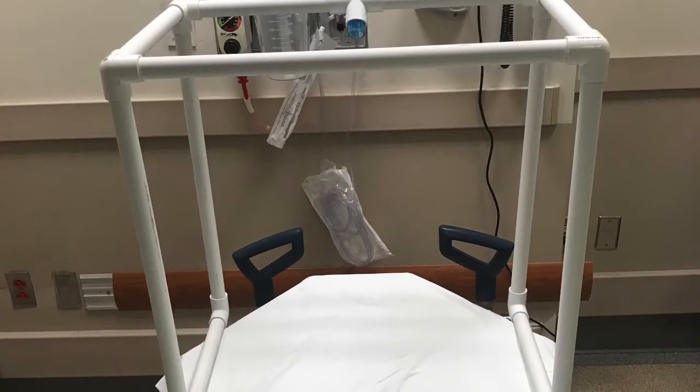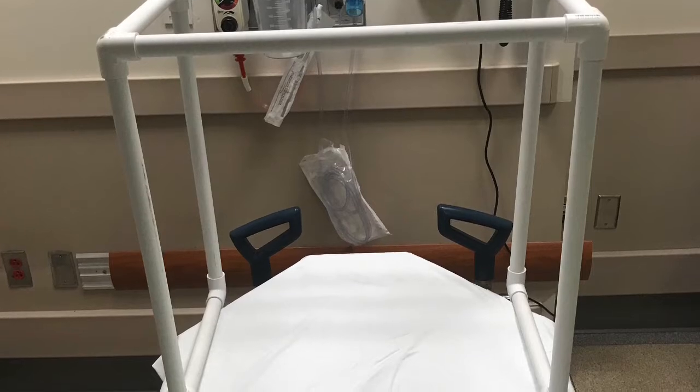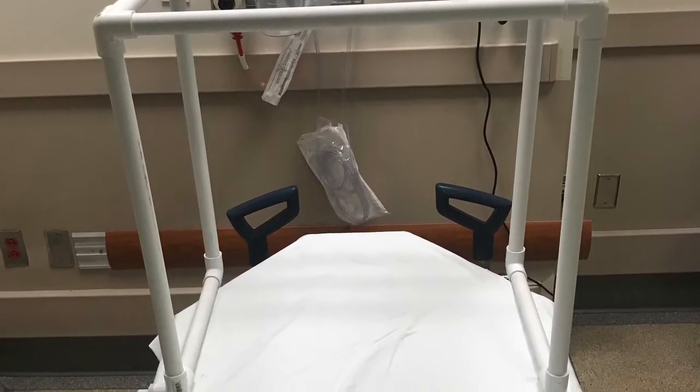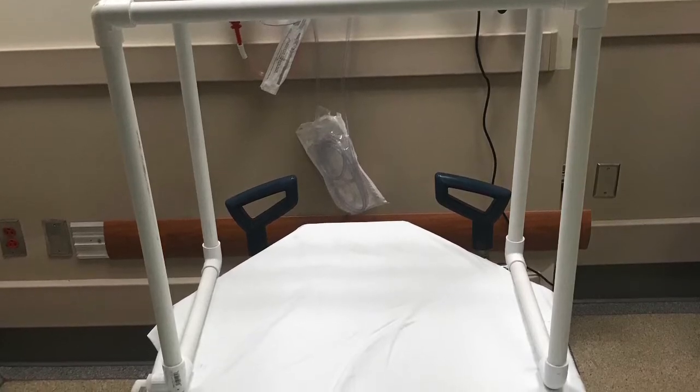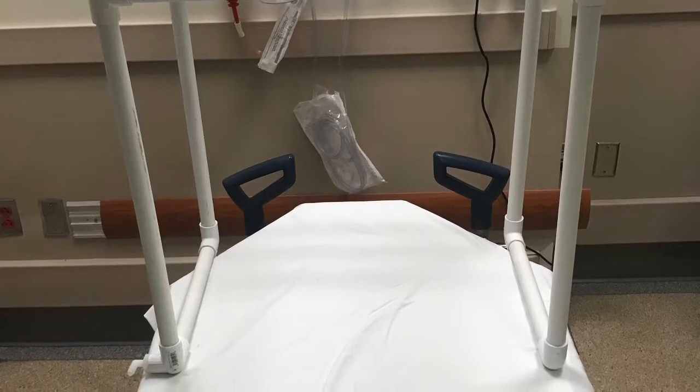In the event that a COVID-positive patient requires intubation, the hood will be placed at the head of the bed overlying the patient's face. While the emergency department technician is preparing the NPE and drape, the respiratory therapist is preparing with the glide scope and equipment needed for intubation.